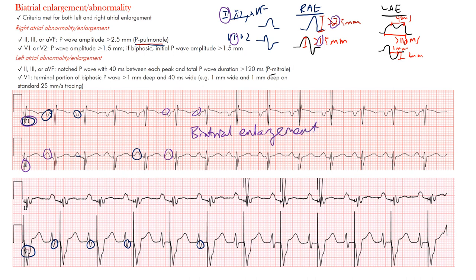The same was true in the second example. Those big spikes are pacemaker spikes, but you can clearly see the left atrial abnormality. You can also see peaked P waves from the right atrium in V1. In lead II you can see that peaking — these are perfect examples of biatrial enlargement.